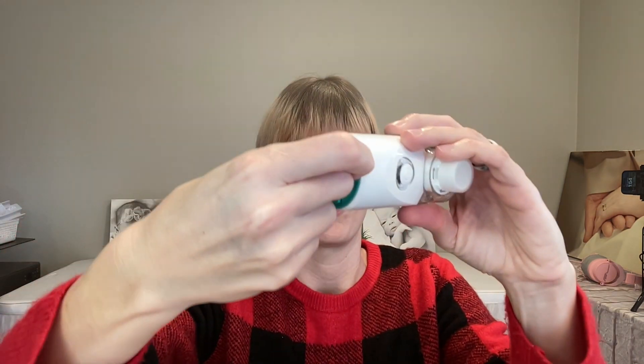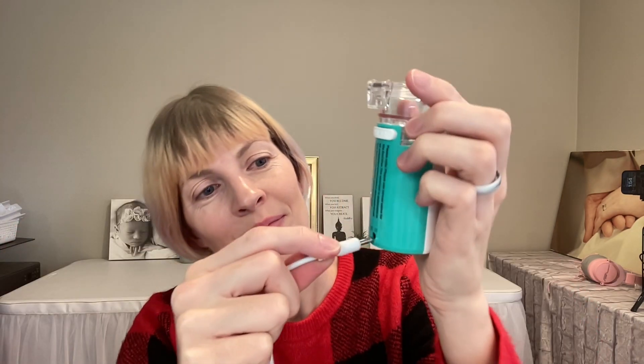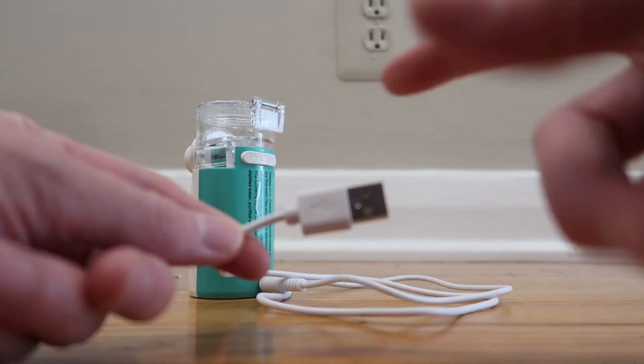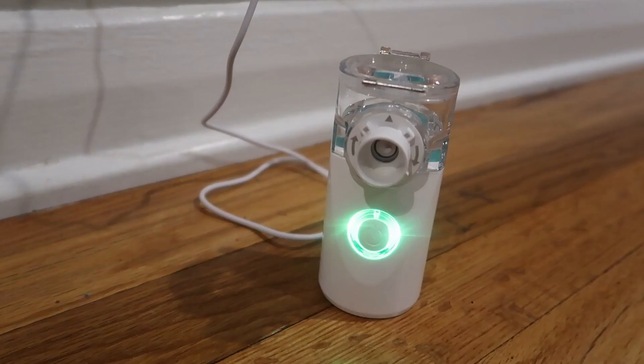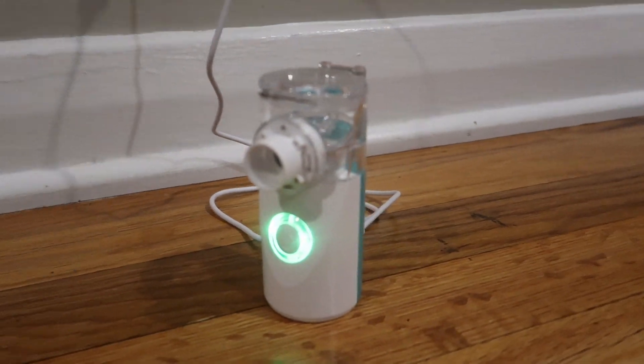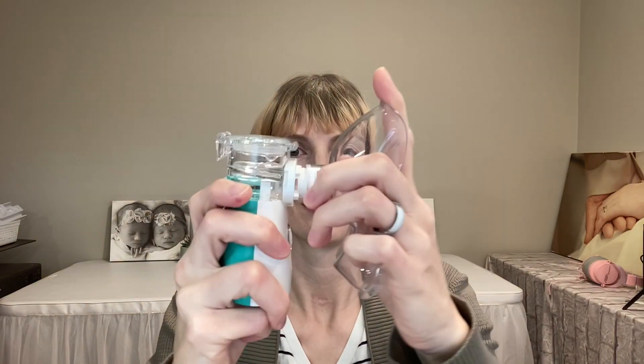It comes with a lithium battery already built in and charges via the included USB cable. They don't include a wall plug, so you have to provide your own. It lights green when it's done charging and will run for about 120 minutes on a single charge.